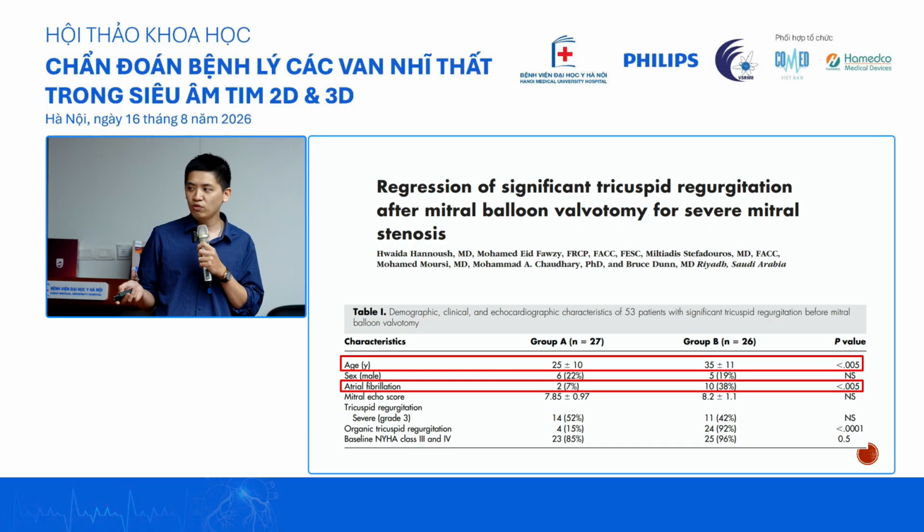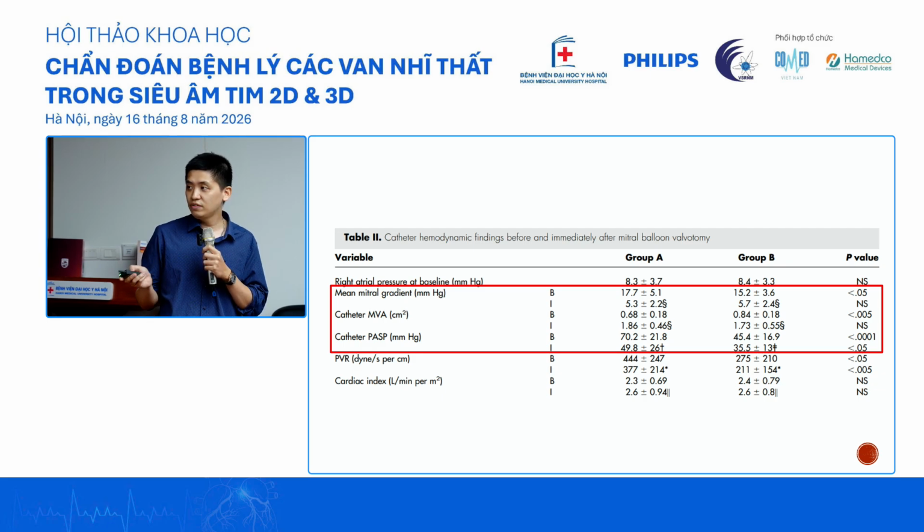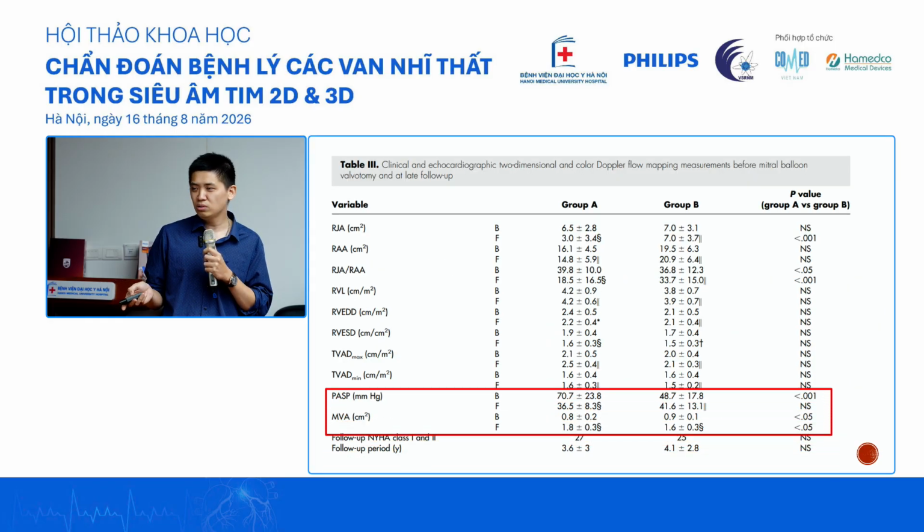They have a suboptimal valve for the procedure, because in this case after the procedure the valve area increased significantly from almost under 1 centimeter to sometimes 2.2, 2.5 centimeters. It was, I say, a very optimal result. Most of the patients we have didn't even get to that level, but over the follow-up time, they experienced no TR regression at all. So that's something to think about when you send a patient for valvotomy with severe TR.